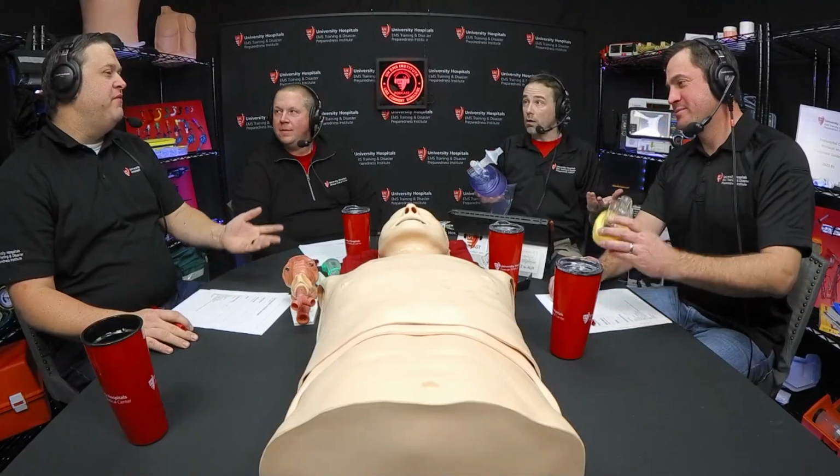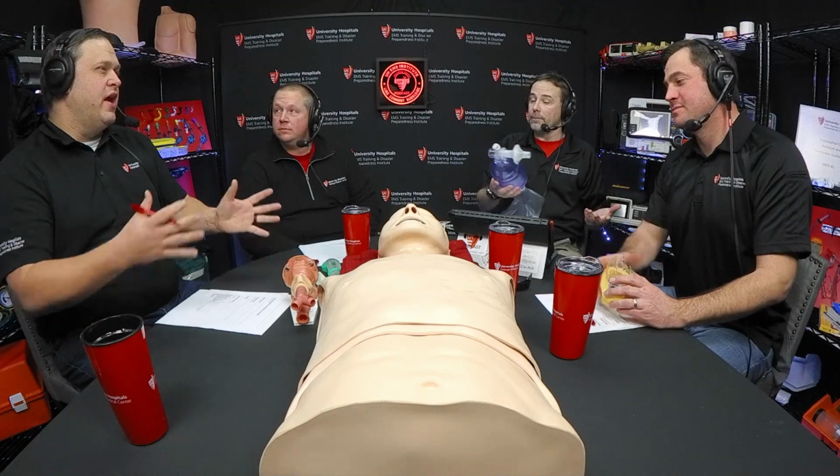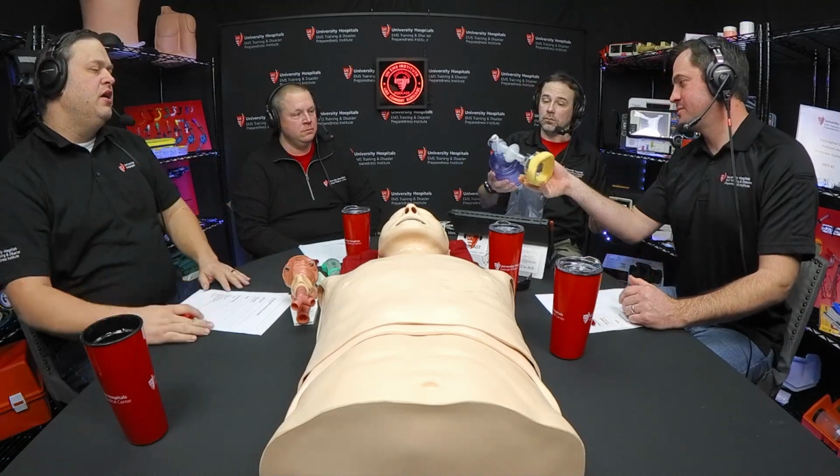You're just pushing air in because the pressure's high, and then you're not giving enough time to have that air come out. And if we continuously bag really fast or push really hard, we're going to create too much intrathoracic pressure, reduce blood return to the heart, and then maybe pop a lung and cause a tension pneumo. So a PEEP valve will help you with that because it's going to keep the appropriate pressure in there.